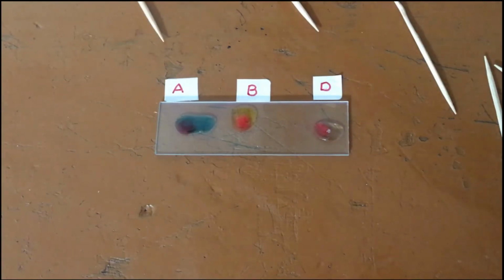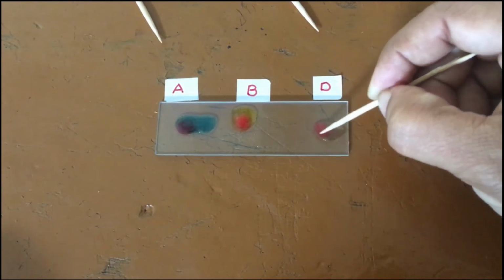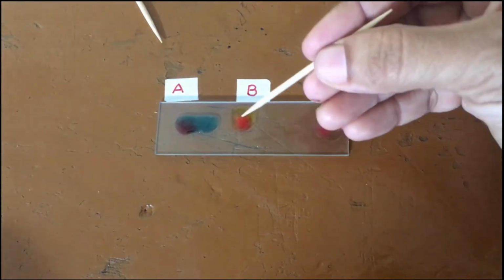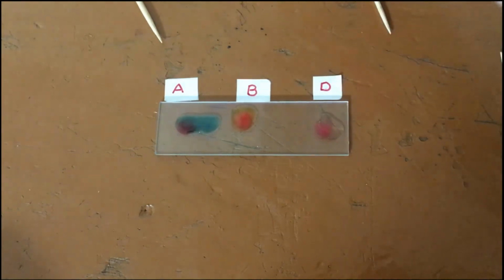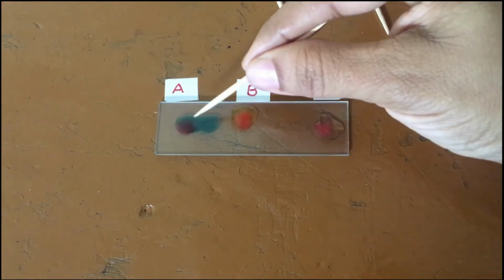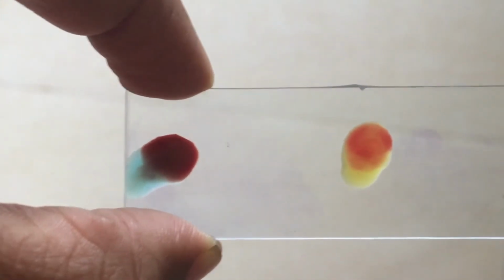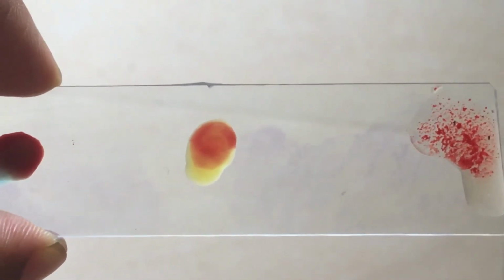After this, we need to mix each drop with a separate toothpick. This is very important. Use separate toothpicks to mix the sera with the blood well to get the agglutination. I am taking a separate toothpick for each drop. Then after mixing, we need to wait for some time and later we can see the result in this way. Here we can see agglutination with respect to anti sera D, and for A and B there is no agglutination. That means this is O positive blood group.